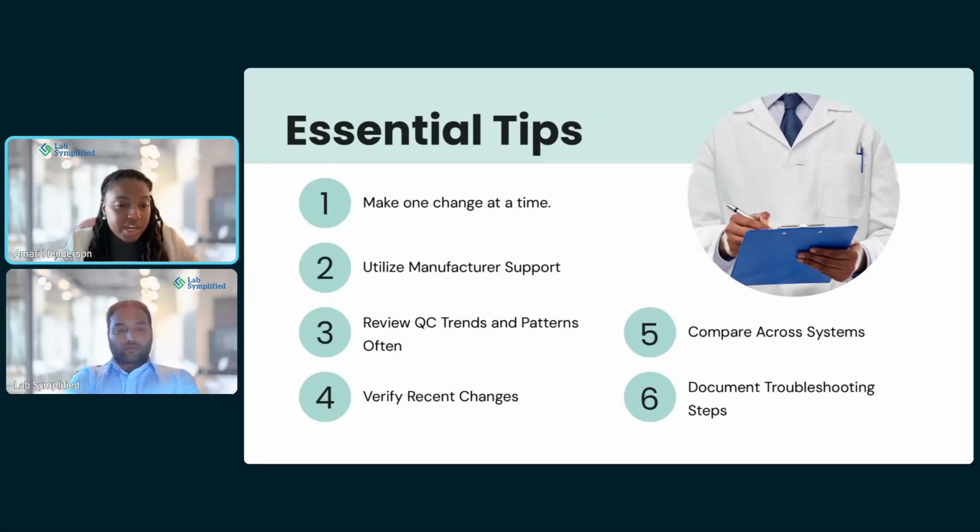Did we change a lamp? Did we change our water source? What did we change around the same time that we noticed the QC shift? Let's look at the dates. Let's correspond and try to figure out what may have caused the issue there.